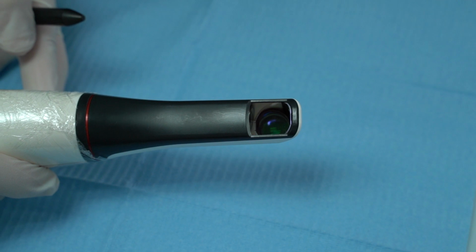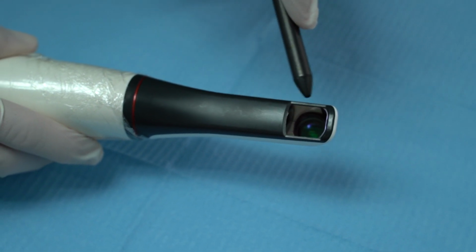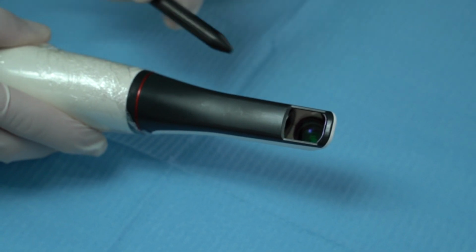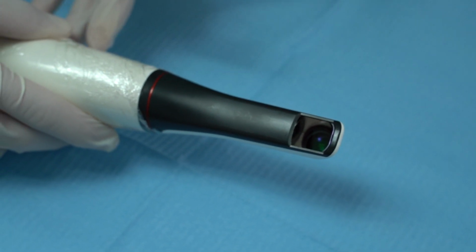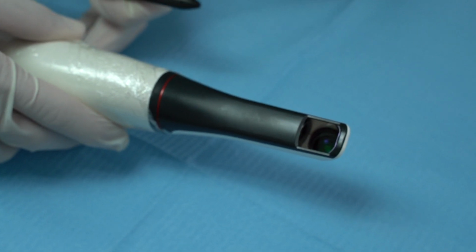Before we start our scan, I advise you to always check the scan tip mirror for scratches or imperfections, because this can affect the quality of the scan. We start scanning from the lower arch as the digital flow of the TRIOS shows us.